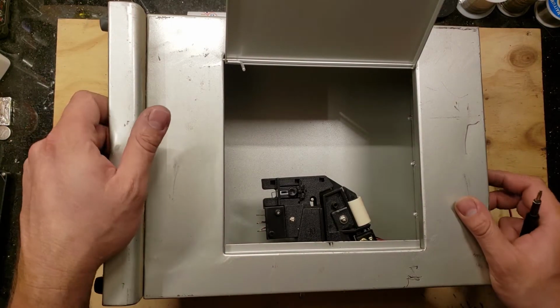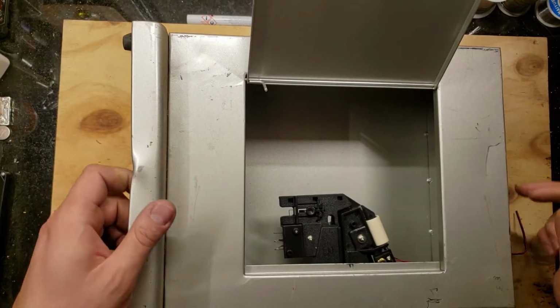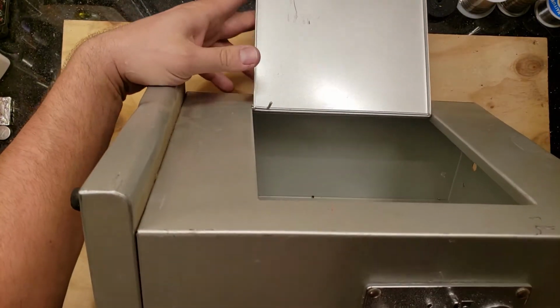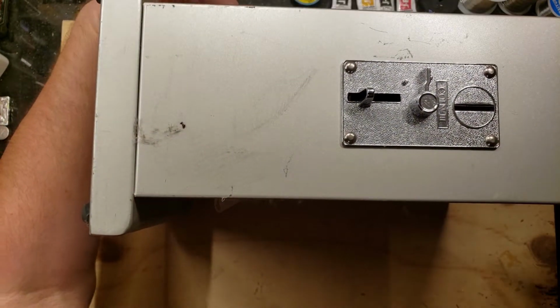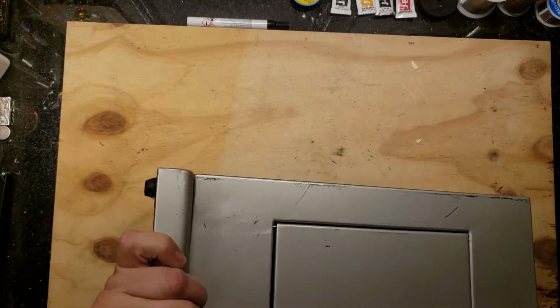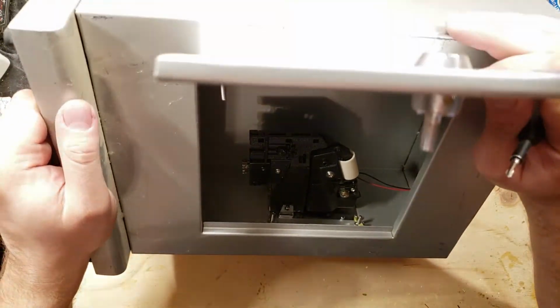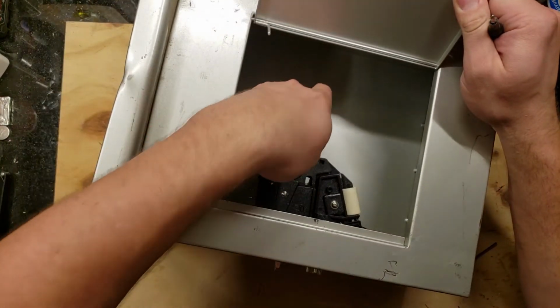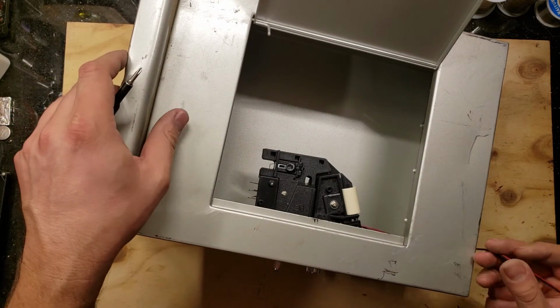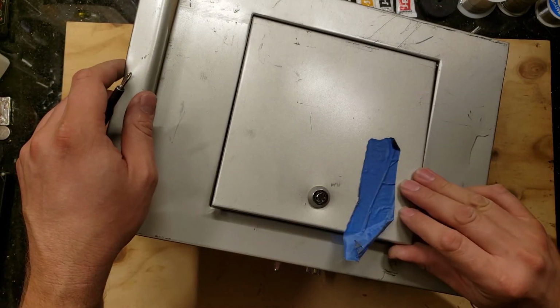The coin acceptor looks pretty simple. It did not want to accept quarters though, so I think it's for some specialized tokens. And then this looks like, well, it's just a pretty sturdy box. It does not look like I can easily remove it. It seems to be riveted in. All it is there, when the coin falls in, there is a micro switch that shorts these two wires together, allowing the machine to operate.